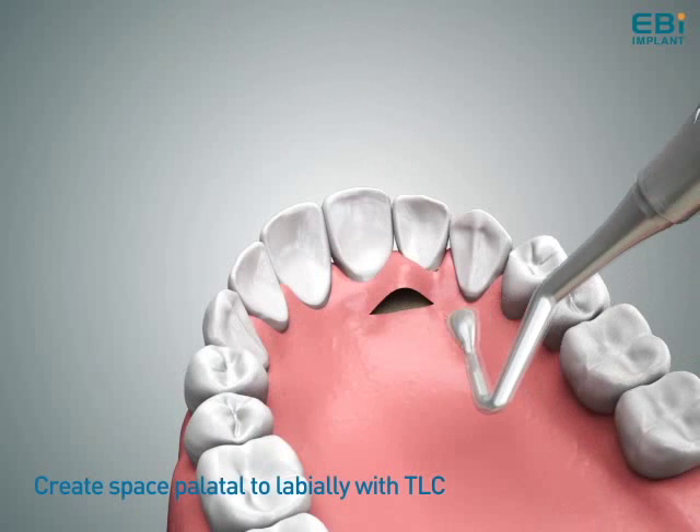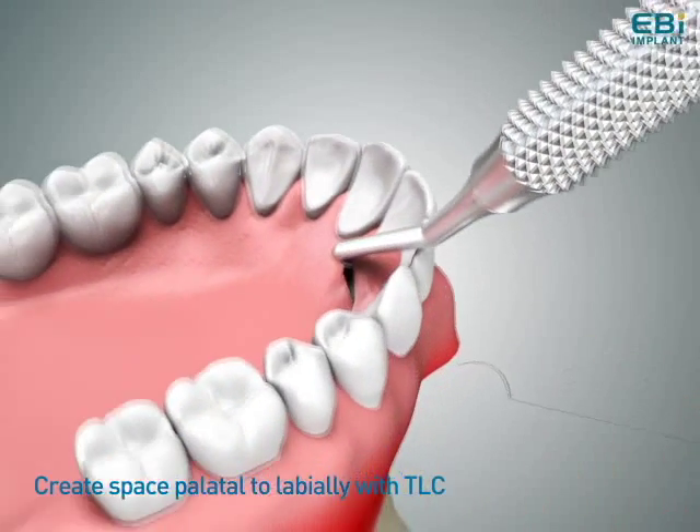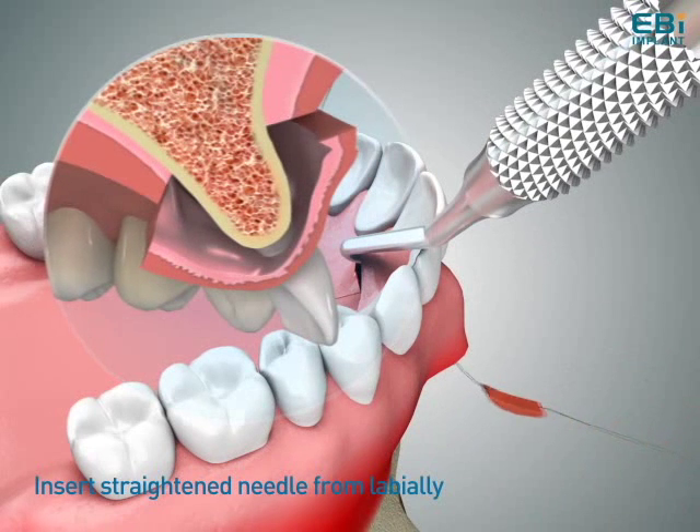Utilizing the TLC minimizes tissue damage, creates sufficient space for soft tissue growth, and promotes efficient blood supply in order to regenerate interdental papilla.